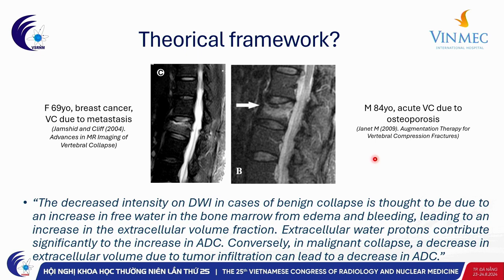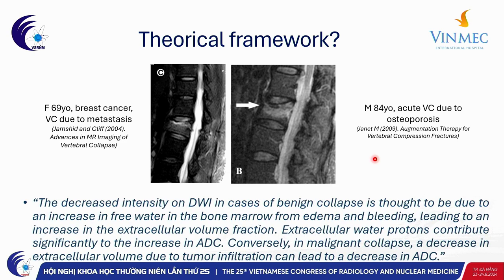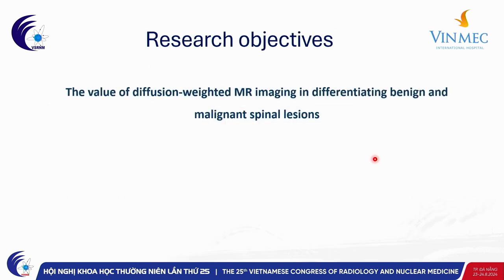But according to Bauer and his colleagues, who did the first pilot research 20 years ago, the extracellular water protons contribute to increase the ADC signal, but the water in the malignant cells contributes to decrease the signal on ADC.